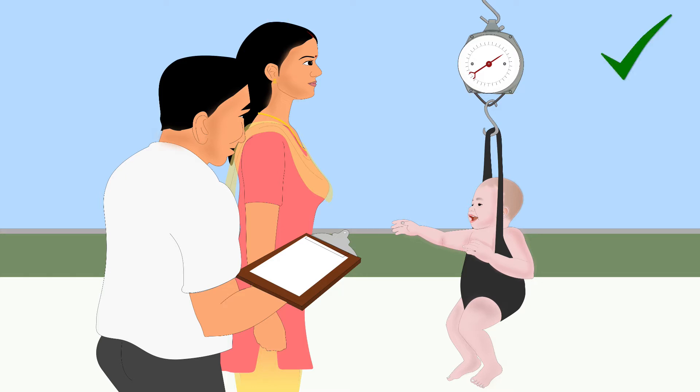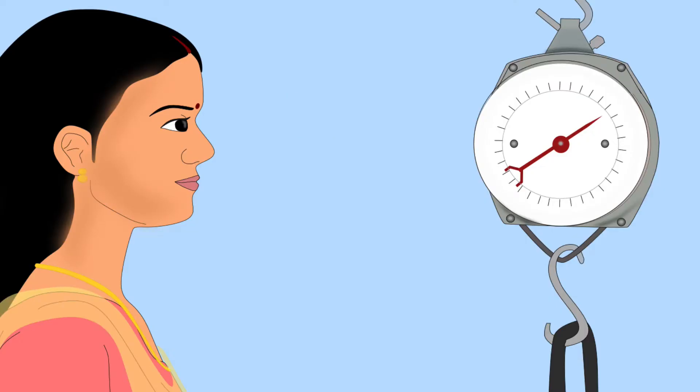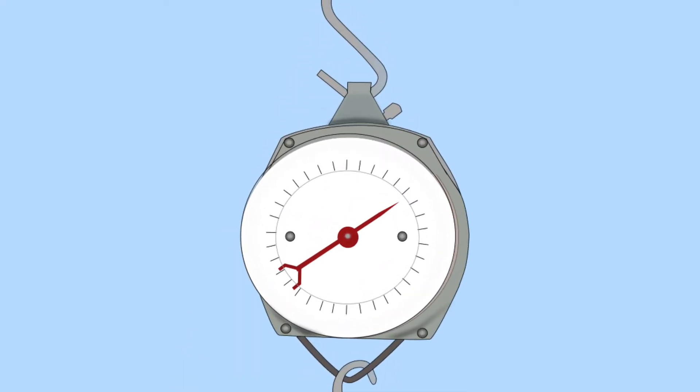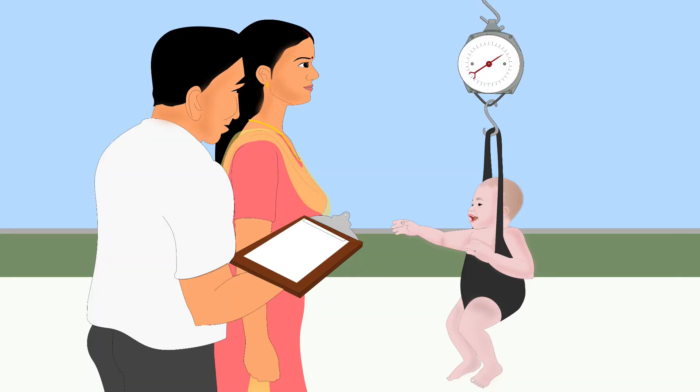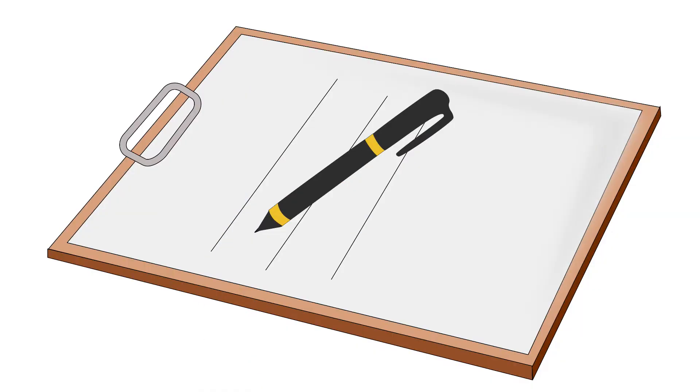Make sure the baby doesn't touch anything. Do not touch the scale or the baby. Stand in front of the scale so that the pointer is at your eye level. Wait till the child stops moving; otherwise, the needle will move when reading the weight. When the child is steady, read the weight on the scale up to the nearest hundred grams mark.